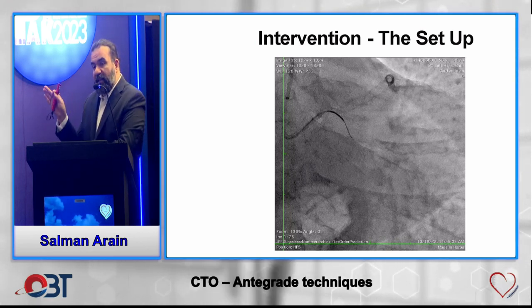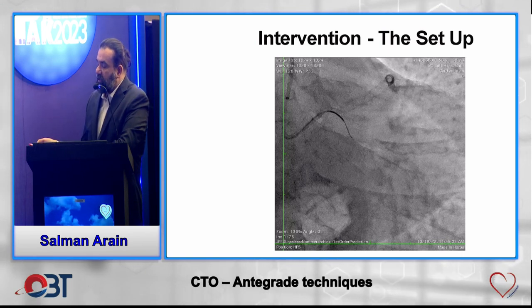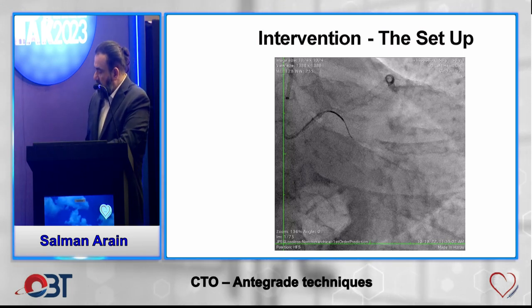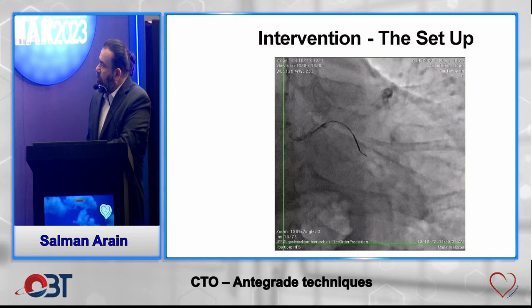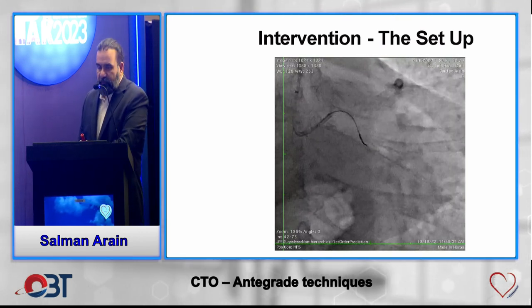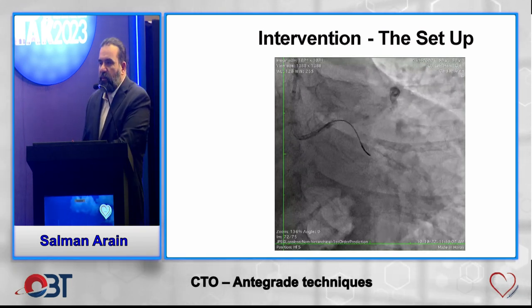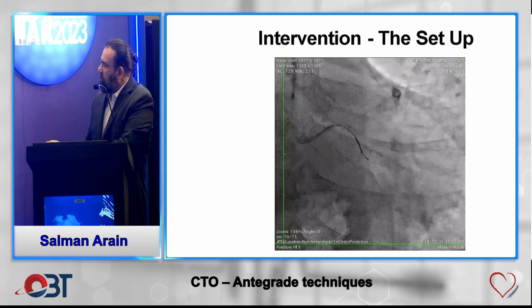Now, I know in Pakistan, the guide extenders are expensive. So if you want to do it, maybe you want to consider using a 7-French femoral access. The other thing I do, I probed it, and you can see that there's difficulty, the wire starts to buckle. So here's the probing of the cap, and you know this is a hard cap. Okay, so it was a somewhat semi-tapered, semi-blunt cap.